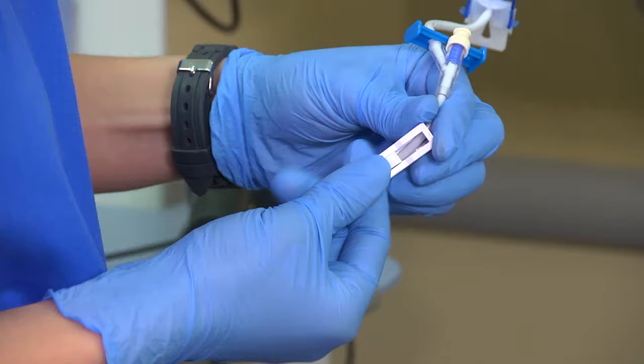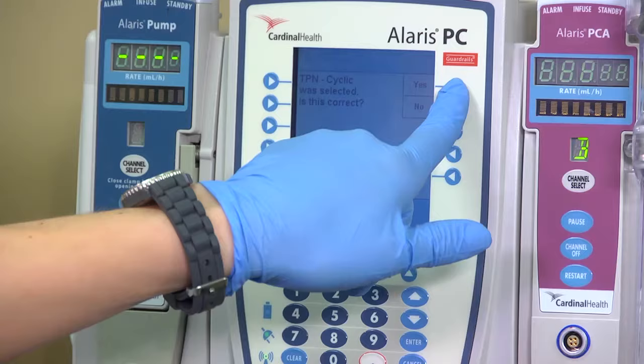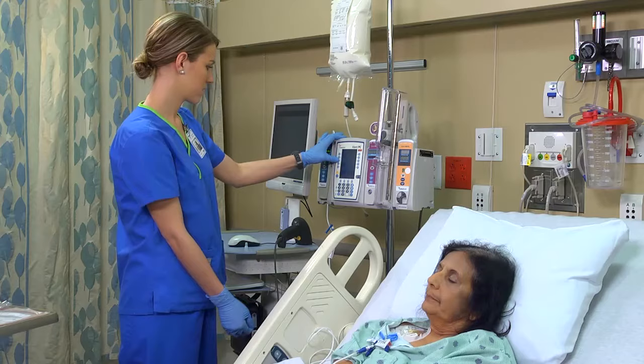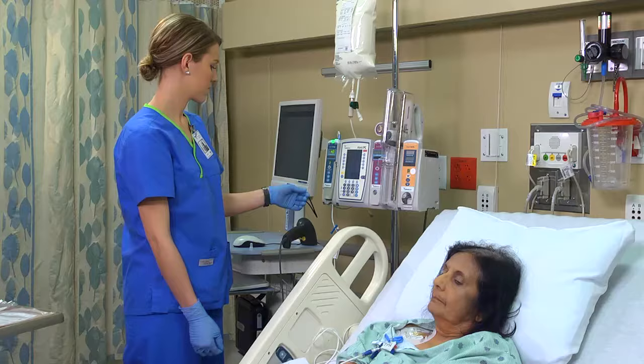Some agencies require that the infusion rate be set immediately to the ordered rate. At other agencies, an initial rate of 40 to 60 milliliters per hour is established first. The rate is gradually increased until the patient's nutritional needs are being met. Refer to your agency's policy to determine the initial rate.